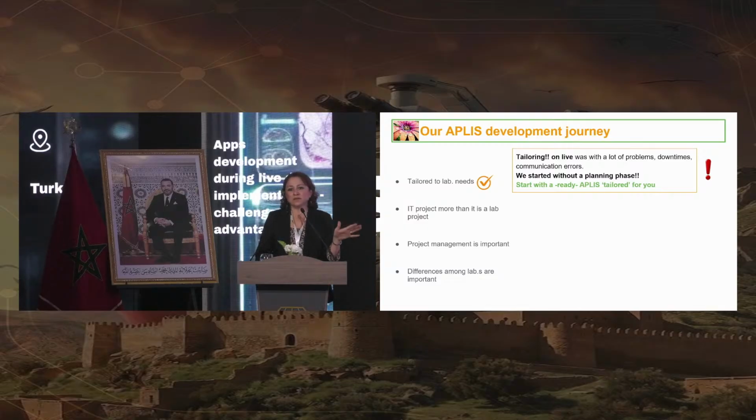But I said, okay, APLIS is a must, and we can develop it. So tailoring is important, but you should tailor before your routine workflow, and you can make it before the scanners. Before thinking about the scanner, think about APLIS and digitizing the workflow. So this is the lesson we learned, and if I build another lab, I will start with APLIS.